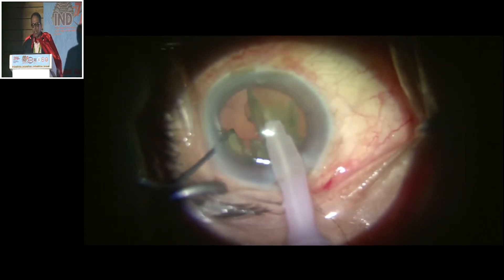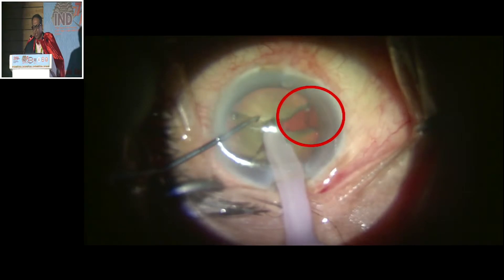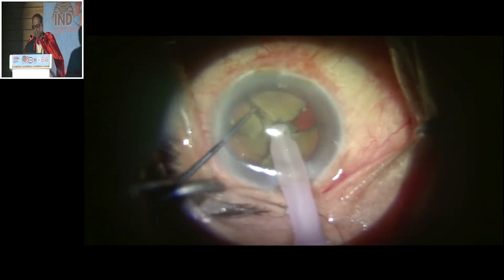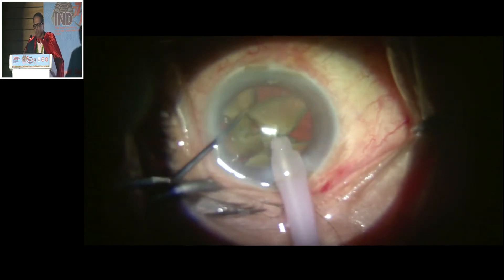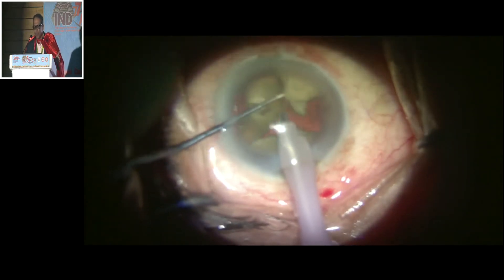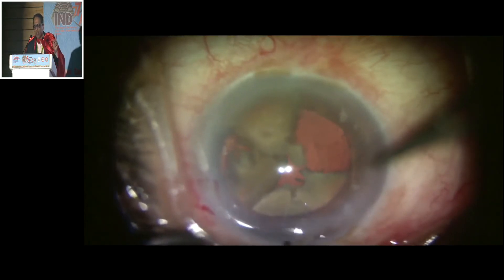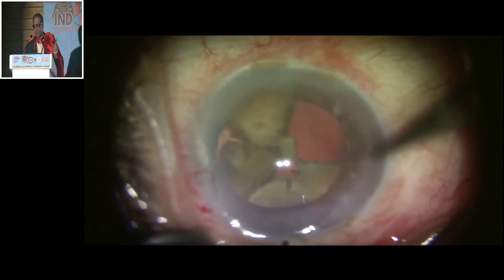Here again when I hold it, I find that there is some zonular dehiscence. So now my plan is to give some support to the bag. Either I go in for capsular hooks or I go in for a CTR. I decide to go in for a CTR to give the horizontal support, starting from the area of zonular dehiscence.